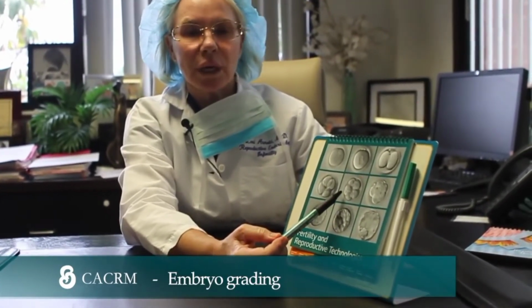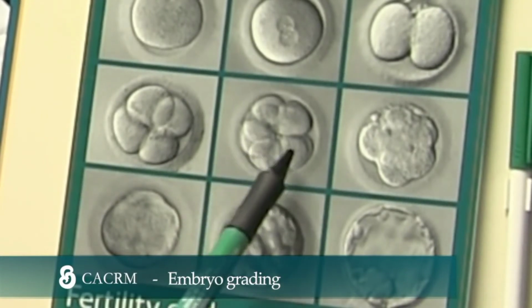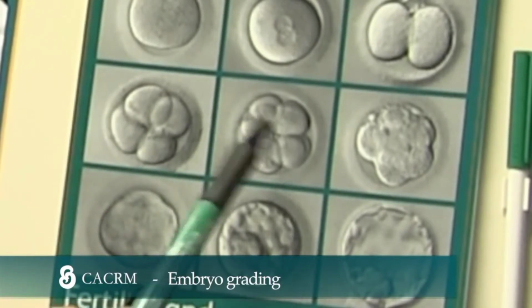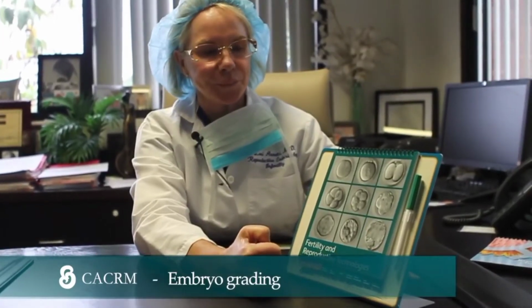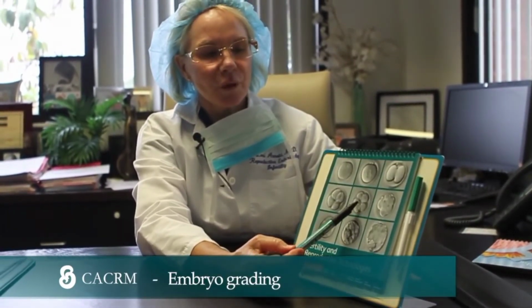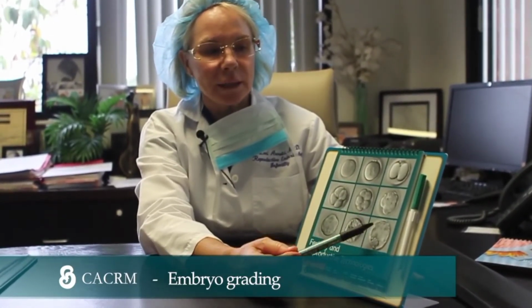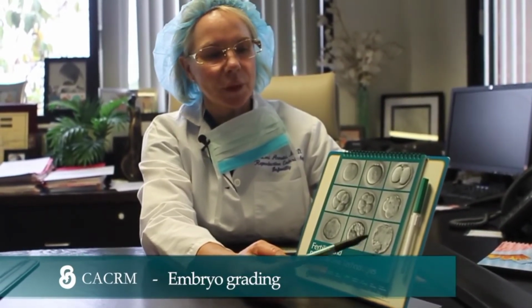On day 3 of embryonic development, the embryo can now have approximately 6 to 10 cells. This is a picture of an 8-cell embryo. Approximately 50% of day 3 8-cell embryos will divide into a day 5 blastocyst.